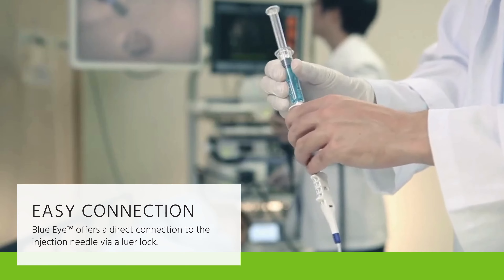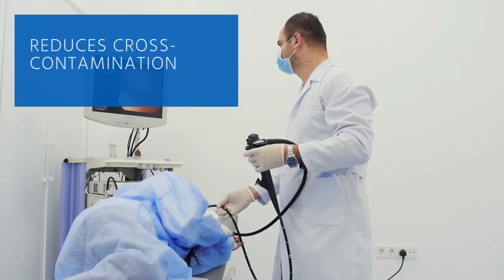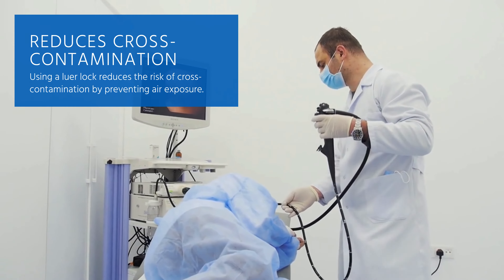Unlike other ampoule products, BlueEye offers a direct connection to the injection needle via a lure lock. By using a lure lock, BlueEye reduces the risk of cross-contamination by preventing air exposure.